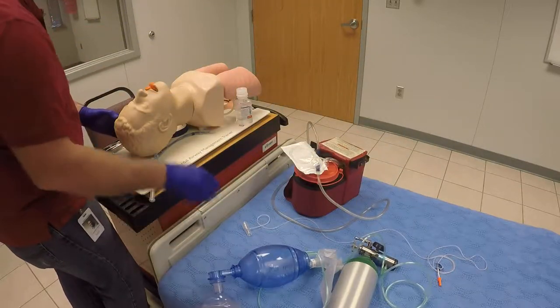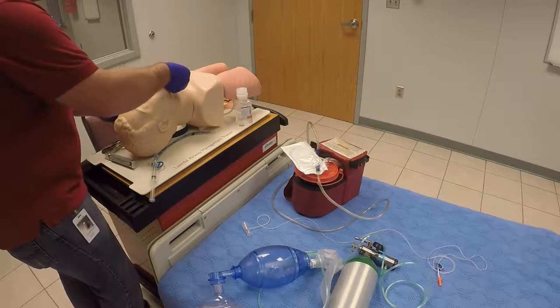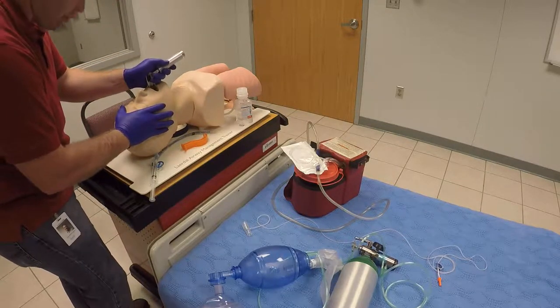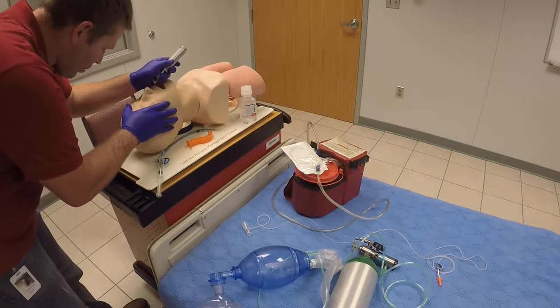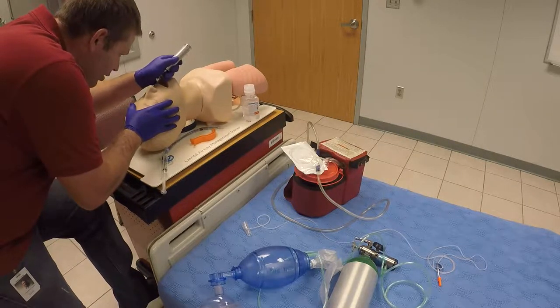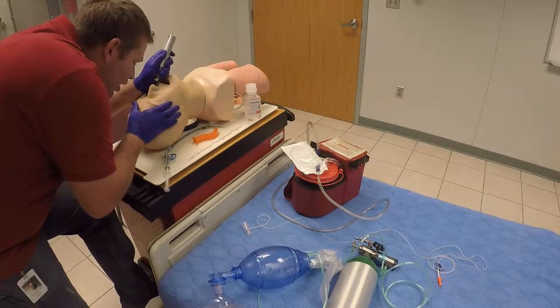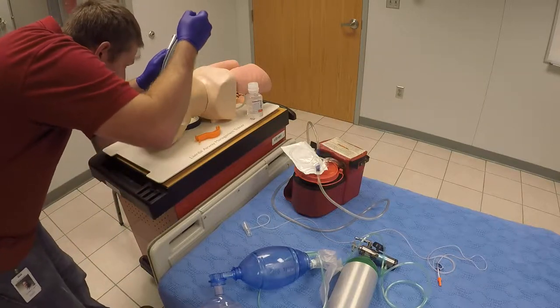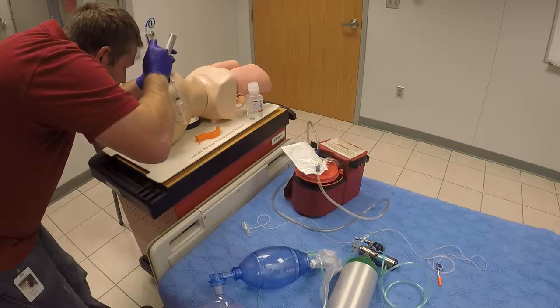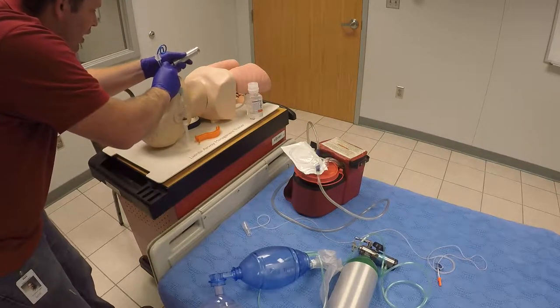Once they're pre-oxygenated, make sure I have my head position properly. Go ahead and pull out the OPA and insert the laryngoscope. Of course in any trauma you want to make sure we're not manipulating the neck at all. Inserting the blade — since I'm using a Mac blade — into the vallecula, elevating the epiglottis so I can visualize the vocal cords. Then pass the ET tube through the vocal cords, just visualizing the cuff passing through.